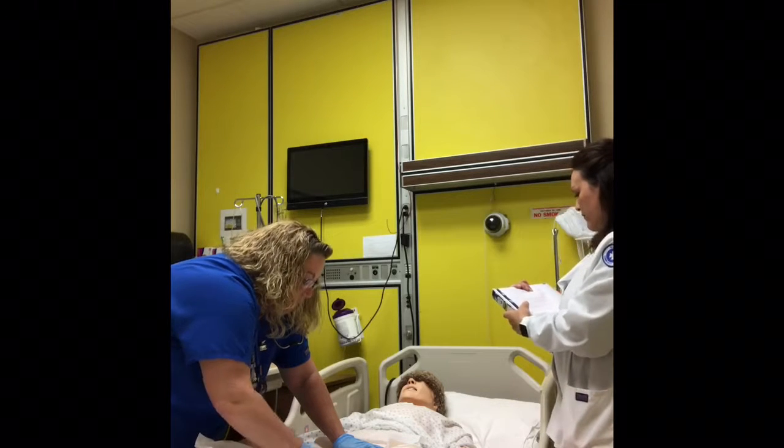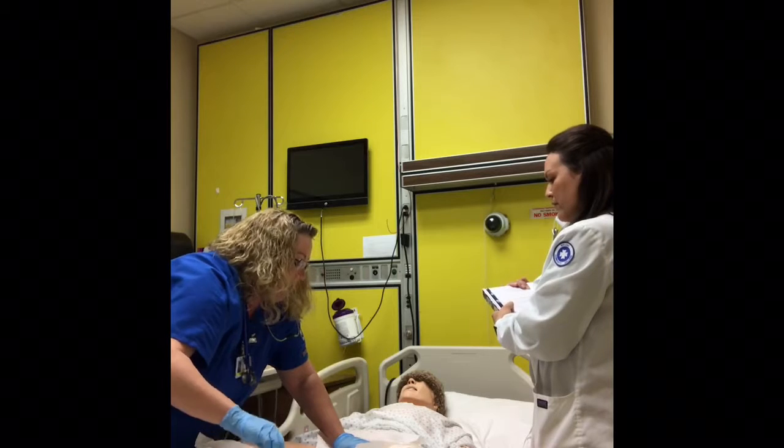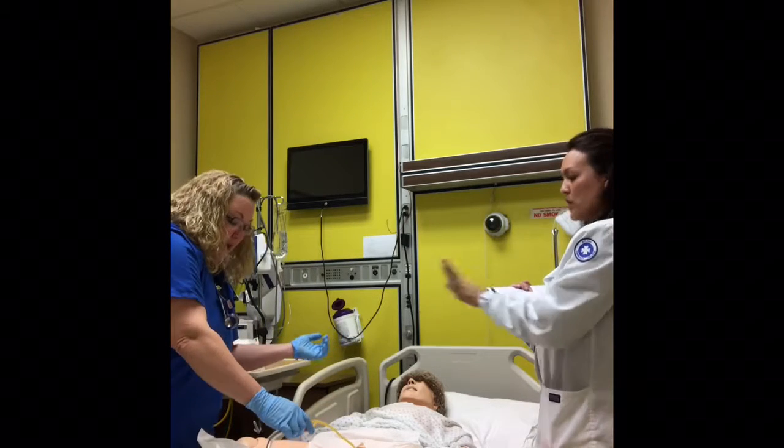And then you push all your fluid in. Then you can take your syringe off. And then you're going to give a little tug. You're going to tug and make sure that it's in place. Then this hand is dirty, so you can let go now.